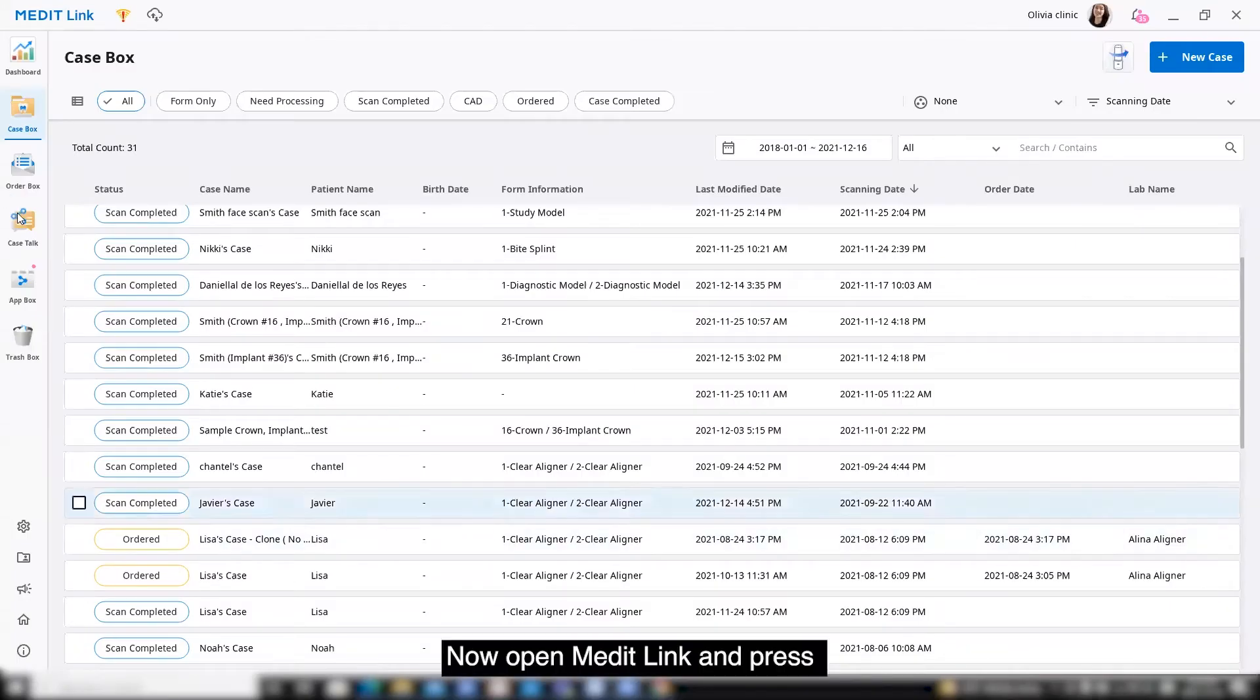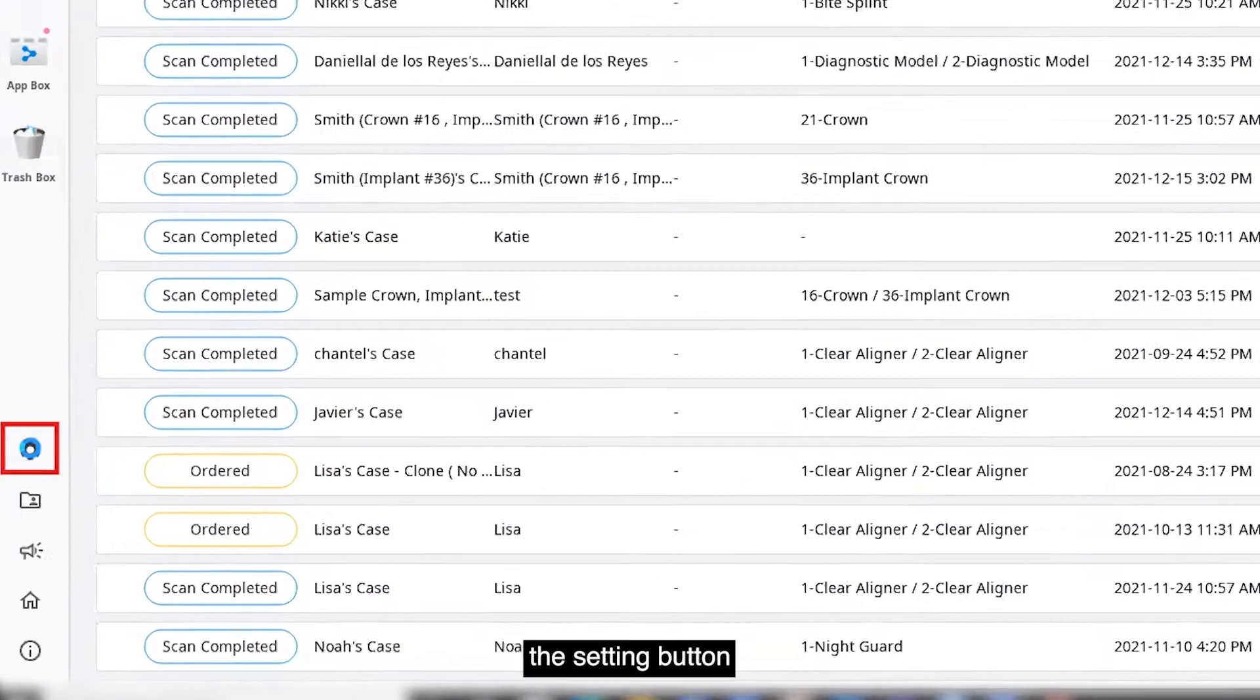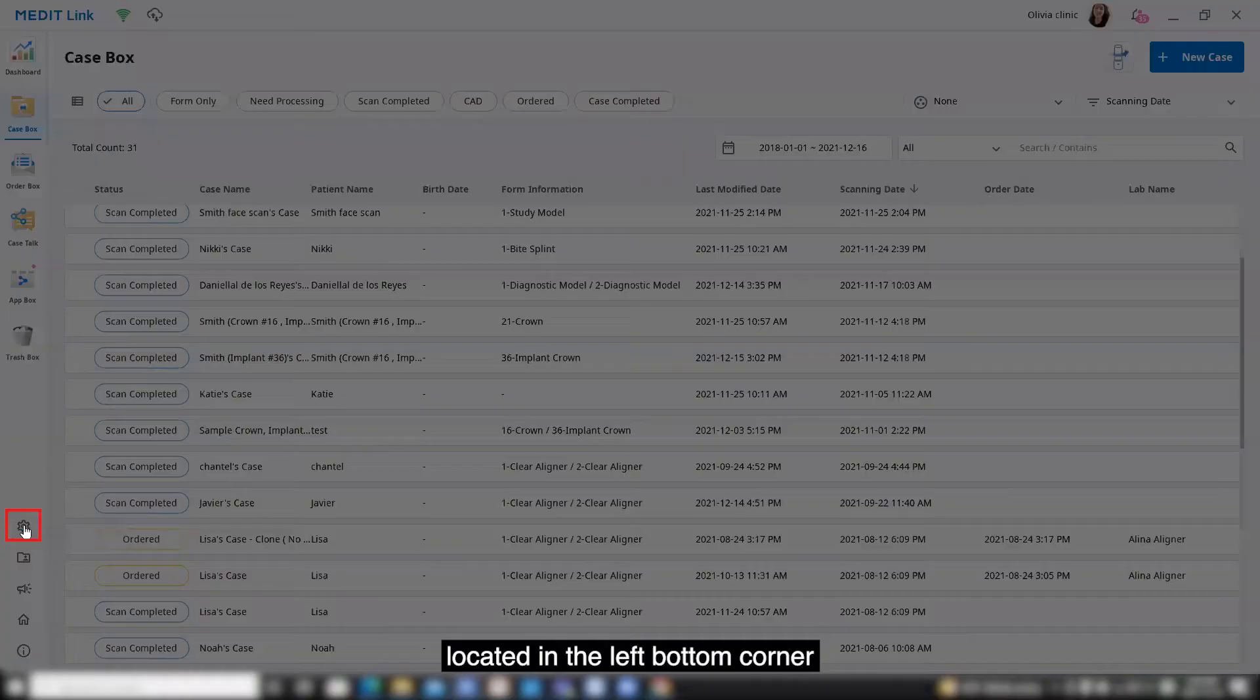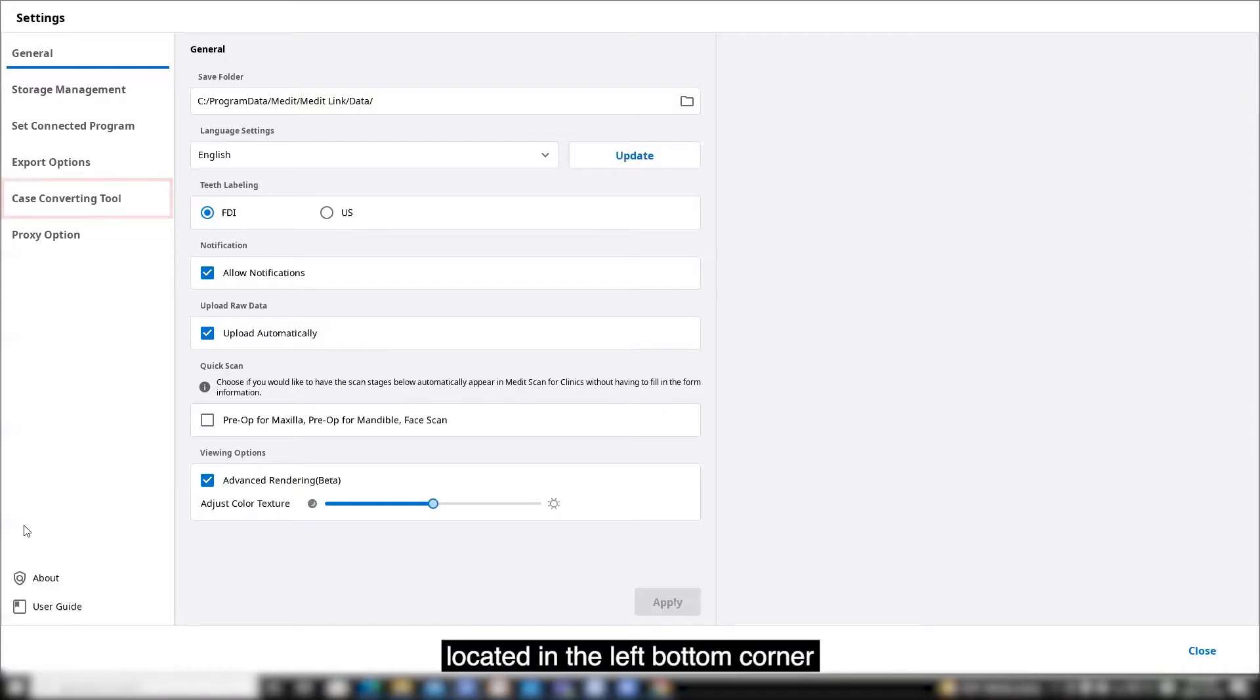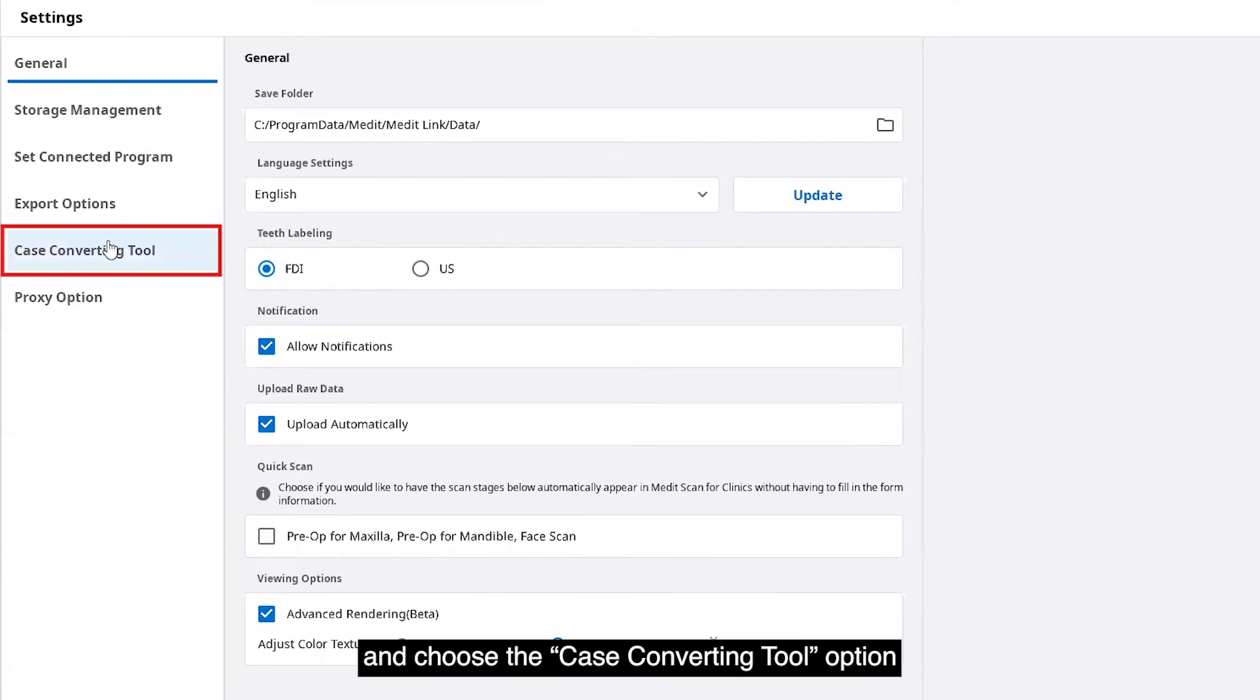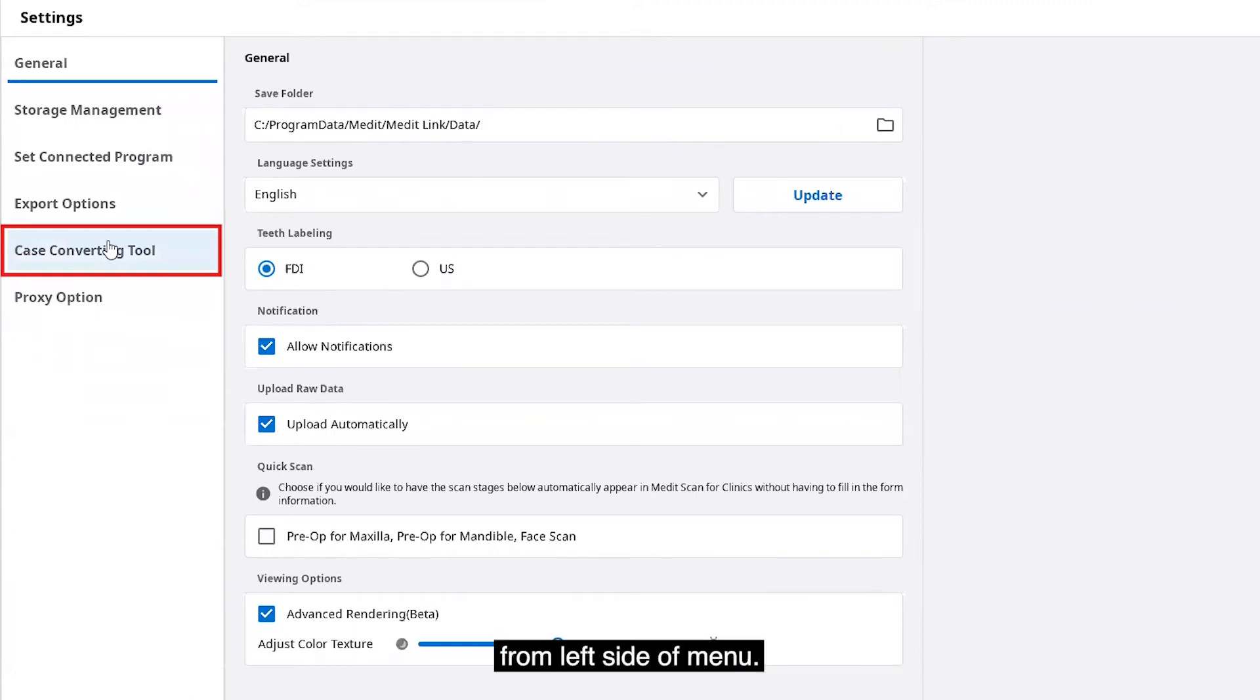Now, open the Medit link and press the setting button located in the left bottom corner and choose the case converting tool option from the left side of menu.